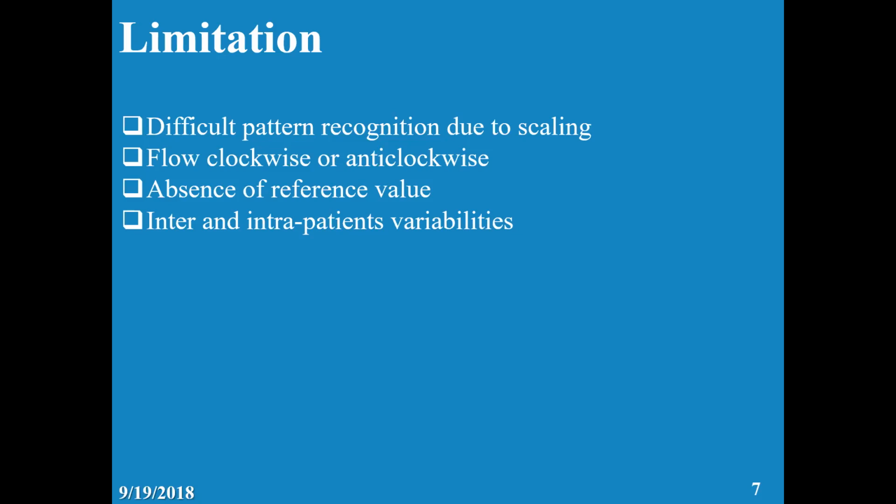There is inter-patient variability, between patient and patient. And also there is intra-patient variability, the same patient at different times. Any question? It's vital to ask questions if you don't understand.